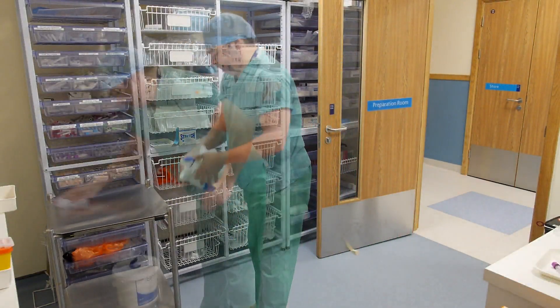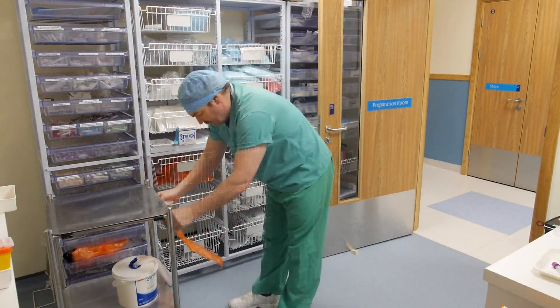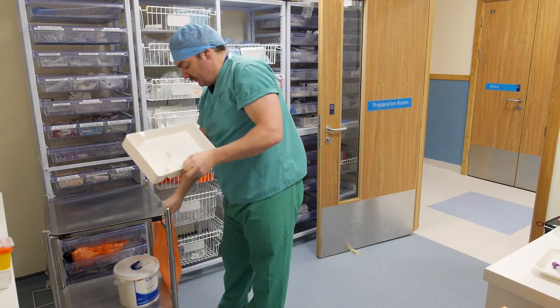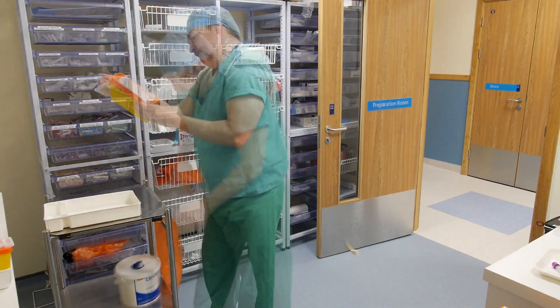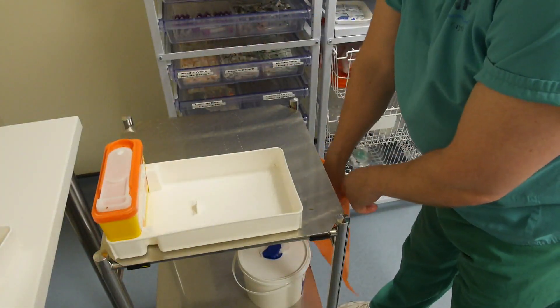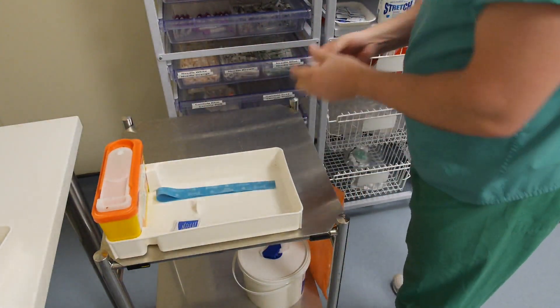When preparing your equipment, clean a dressing trolley with detergent wipes to provide a clean working surface and attach a disposal bag. Thoroughly clean the sharps tray and sharps bin, and assemble all the necessary equipment for venipuncture, checking packaging and expiry dates.